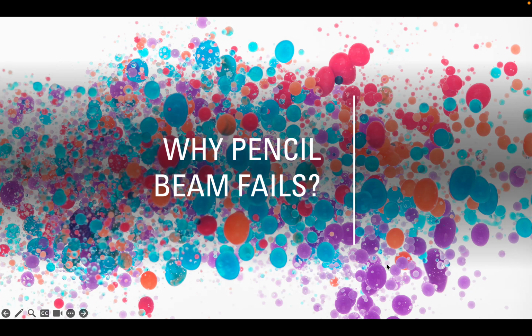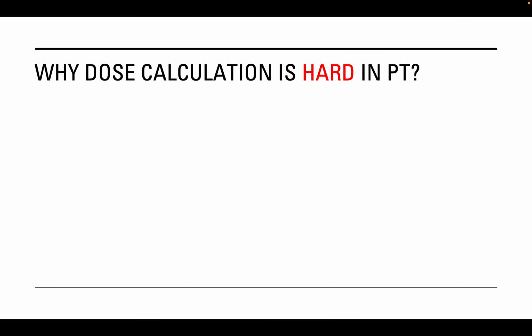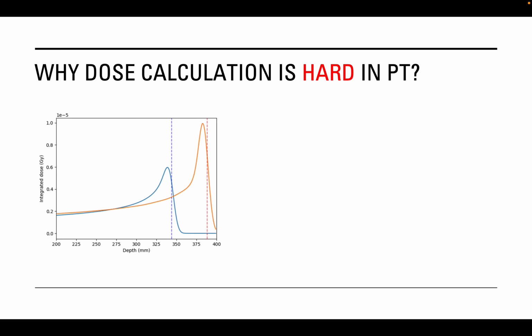In this short video, I'll discuss why pencil beam fails in general, but especially in proton therapy. First question that comes to mind is why dose calculation is hard in proton therapy. Protons are very sensitive to what they pass through.